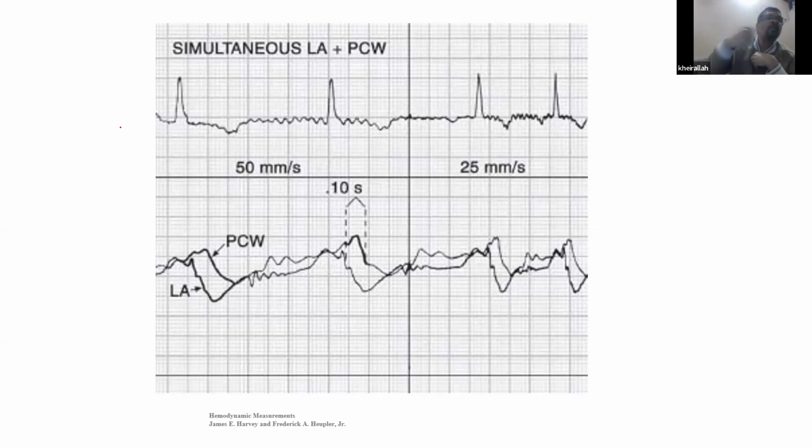Some people say going retrogradely by the aorta, and bending the catheter back into the left atrium, kind of retrograde. But even this is invasive. Why? Because the cost is that we go for an arterial puncture instead of a venous puncture. But the wedge does not necessitate any arterial puncture. We go venous, femoral for example, and then we go to the right side and negotiate our catheter until we lodge into the pulmonary artery and we check the pressure from there.